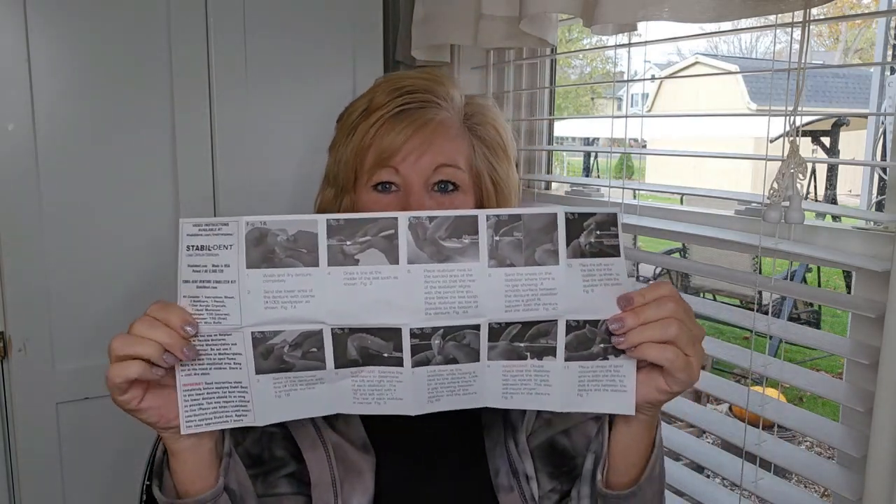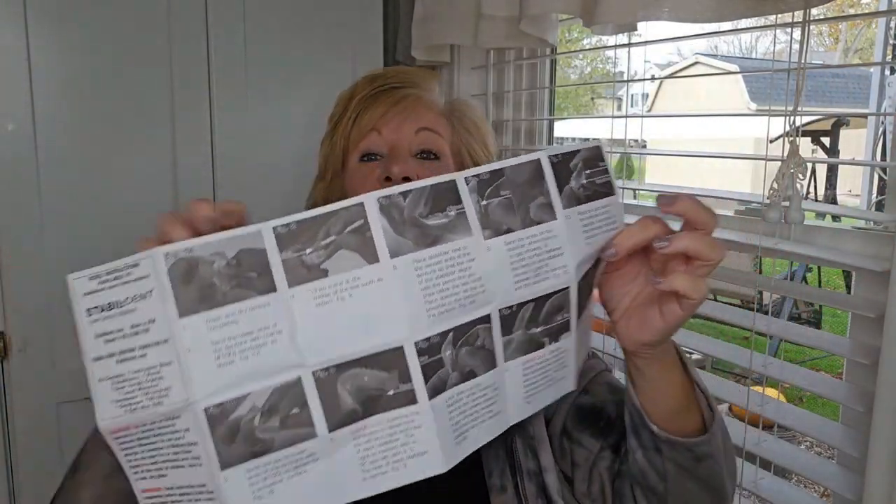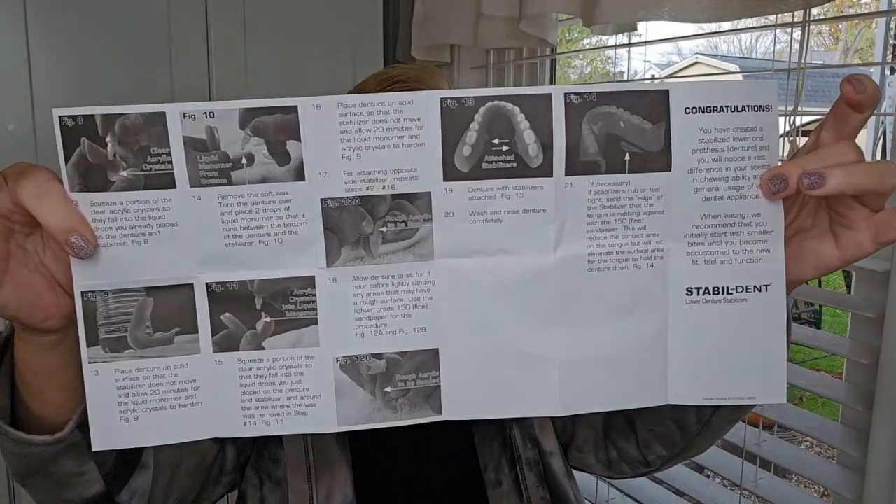They say to read the directions in full before you start this process. Here are the front steps, and then you turn it over and there are more steps on the back. I watched the video — they have a video on their YouTube channel doing this. I'm going to be watching that video and following along, but we're just going to get my denture done.